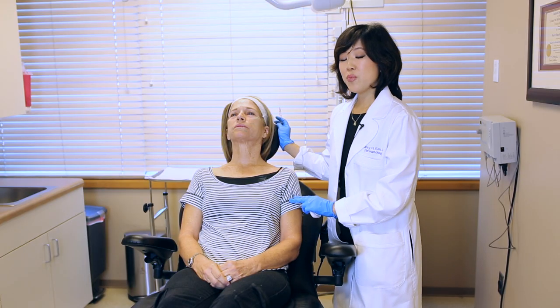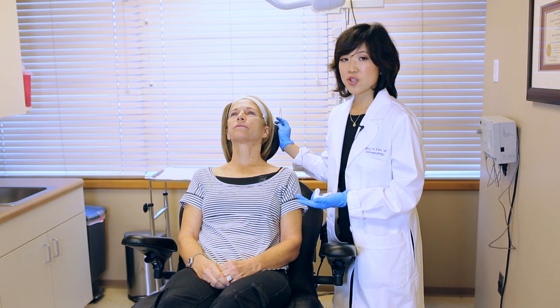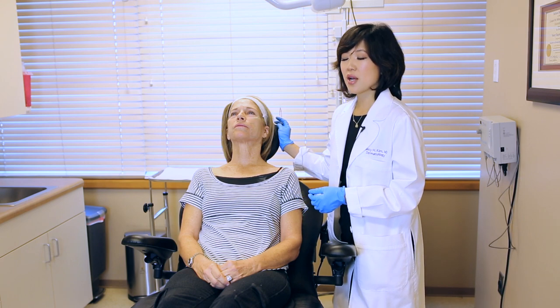We've now moved to the laser room, and at this point we're going to start with the numbing shots, which are a lot like dental shots, essentially.